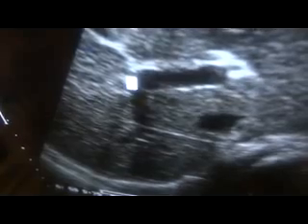These are both right and left portal veins seen together. This is the right portal vein, this is the left portal vein, and this is the inferior vena cava. The echogenic borders around the left portal vein are clearly seen, but this right portal vein does not show any significant amount of periportal echoes.